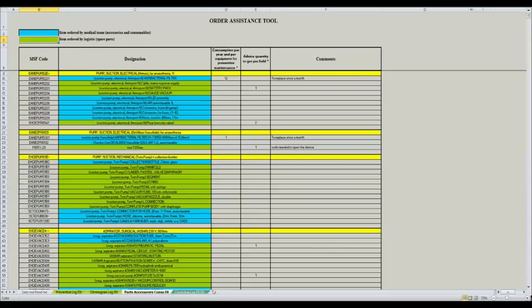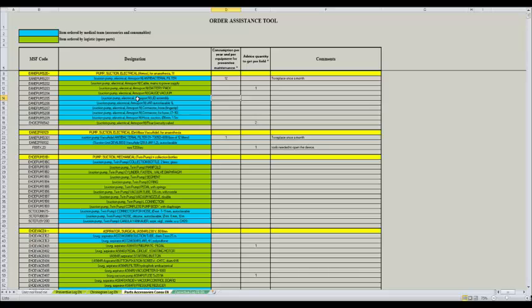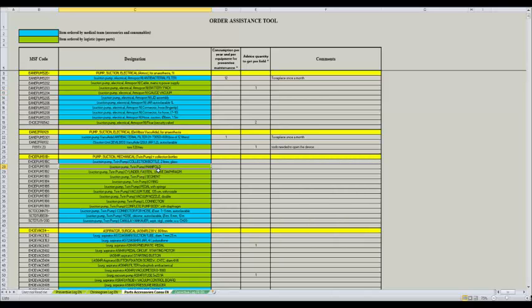The last two columns are information to help you define the basic needs that a project would require for one machine. This list of consumables and spare parts also includes items that do not have to be in the regular stock, but that can be ordered in case of failure of the equipment. The first time that you use this file can be confusing. Therefore, do not hesitate to ask for the support of the biomedical referent of your section.